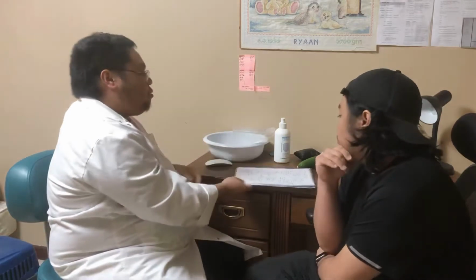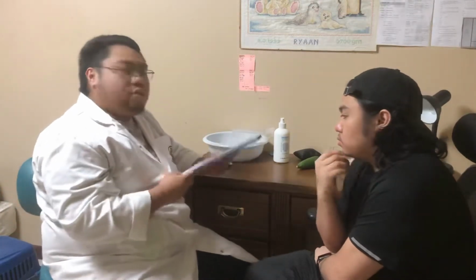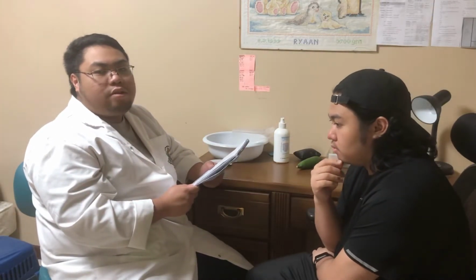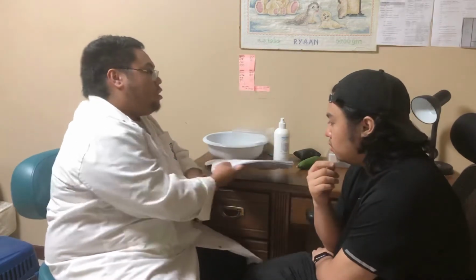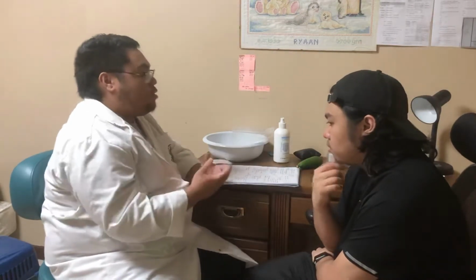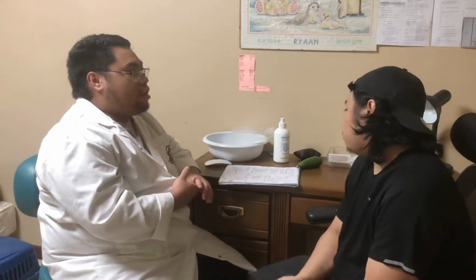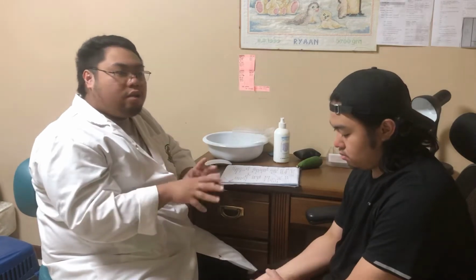So after this, we're going to read the doctor's order. It is to obtain pertinent data about the patient. So here it is stated that the patient needs a radial artery ABG analysis for normal checkup. And now, we're going to instruct our patient, tell them the purpose, procedure, and responsibilities. This is due to the fact that any cause of sudden emotion in the patient, like anxiety, weariness, or confusion, might cause hyperventilation. It might alter the patient's ABG result.